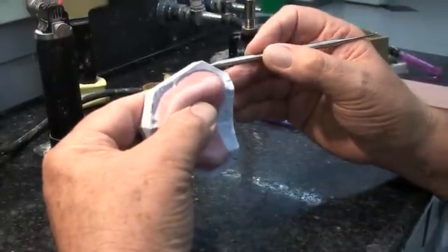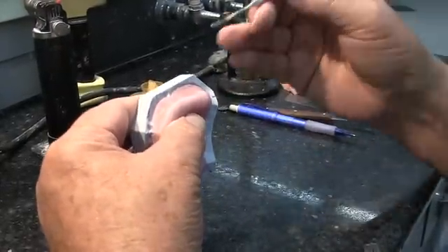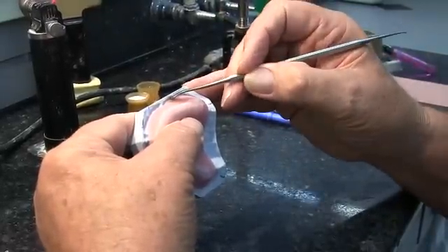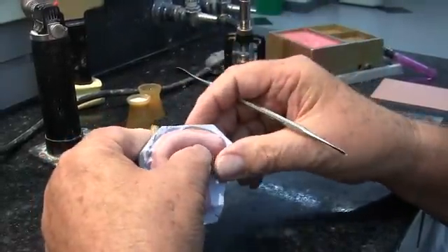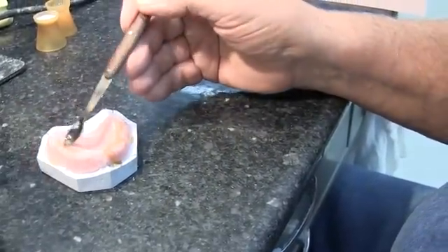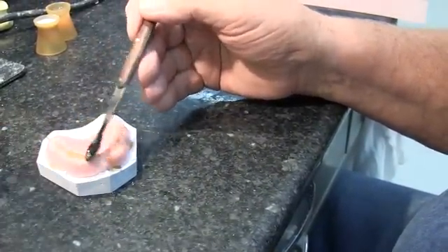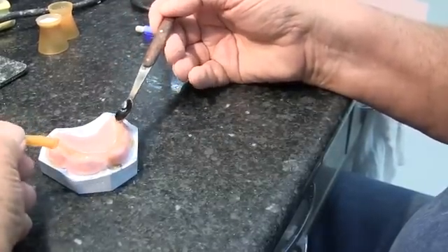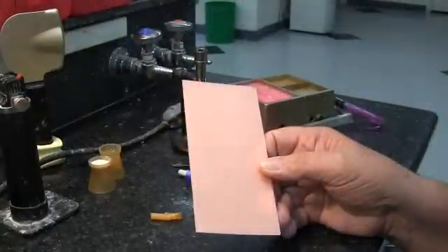We already have our LightCure baseplate fabricated. If it's a little bit loose, you can lute it to the cast with a little bit of sticky wax. We've also roughened up the surface of the baseplate material, and we're now applying sticky wax to help adhere the baseplate wax to the baseplate.